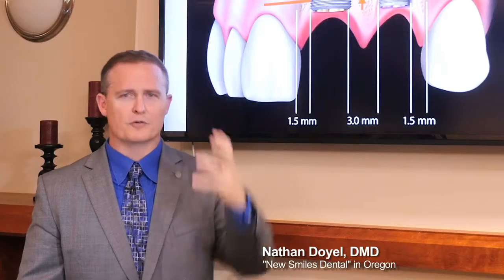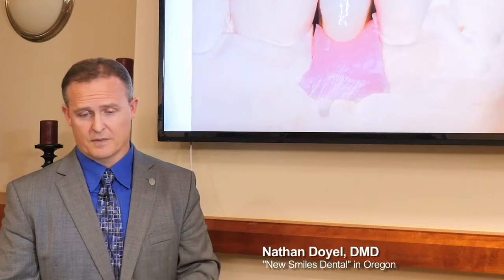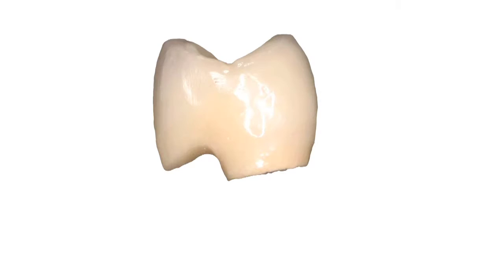Well, that didn't make any room for running room or for the abutment to be placed, so it put it right at the same height. And I'll show you an example of this. Well, it should have been placed a little bit deeper, and this is an example of it. This looks fine right here, looking at the prosthetic on the model, but once you look at it closer, they got the zenith right there, but what was really happening is that it actually looked like this.